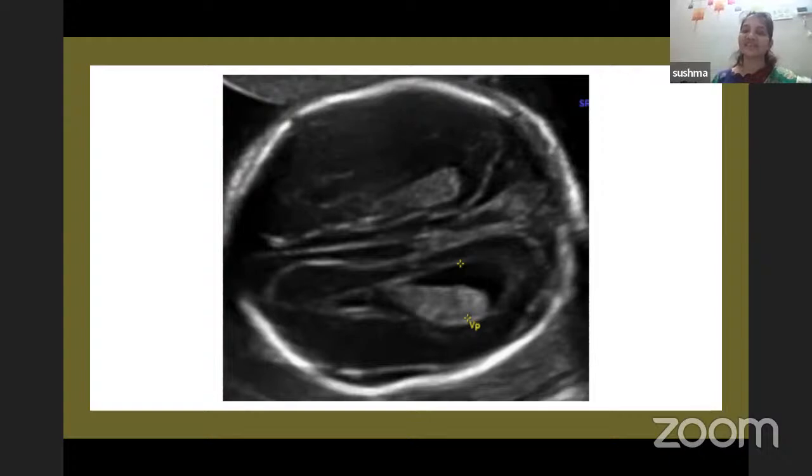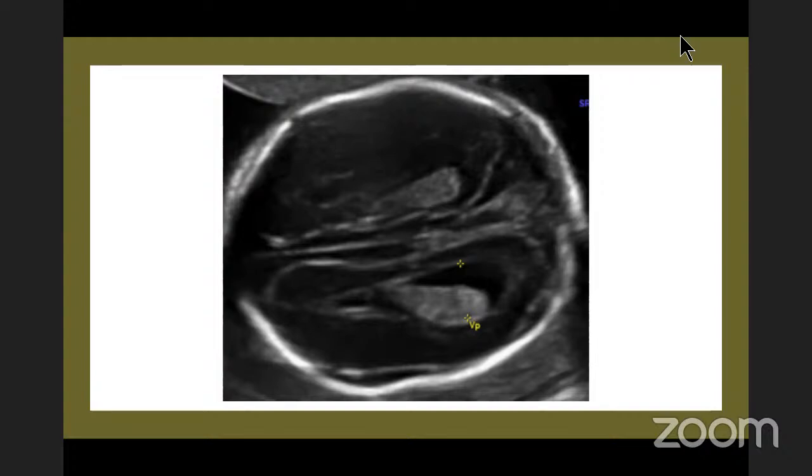And one Dr. Priyanka, ACC. Yes, ACC is agenesis of corpus callosum. So CSP is a very important structure that we make sure to look at in all the 3 axial planes, because it has to be seen to diagnose agenesis of corpus callosum. We have to see it to rule out ACC and to diagnose that corpus callosum is normal. Two more answers: corpus callosum agenesis, and falx cerebri.